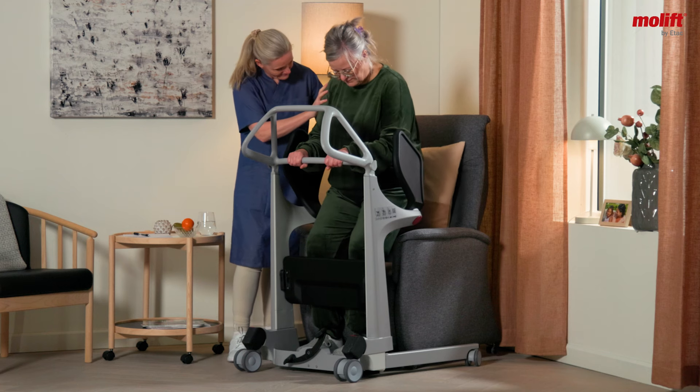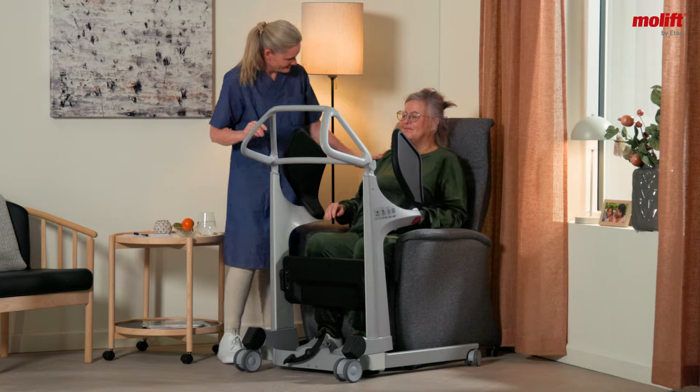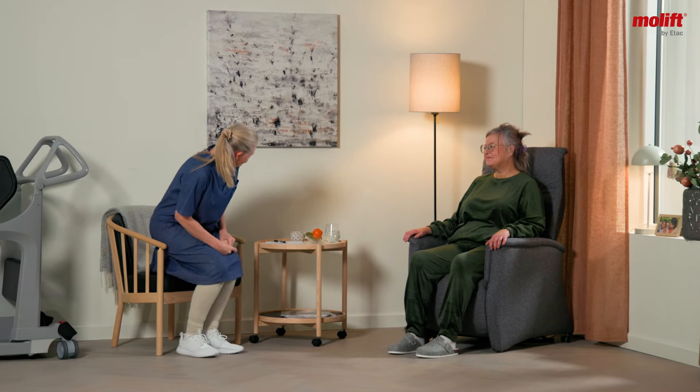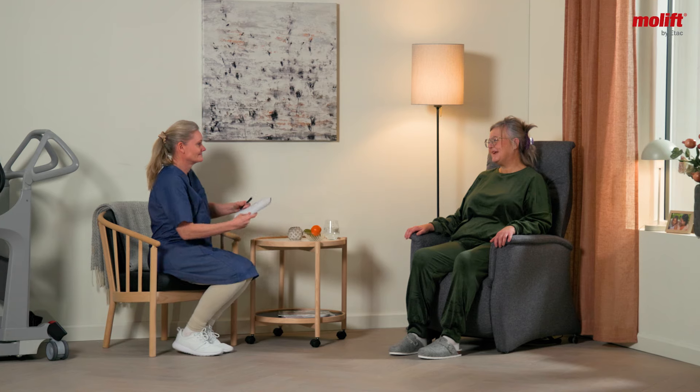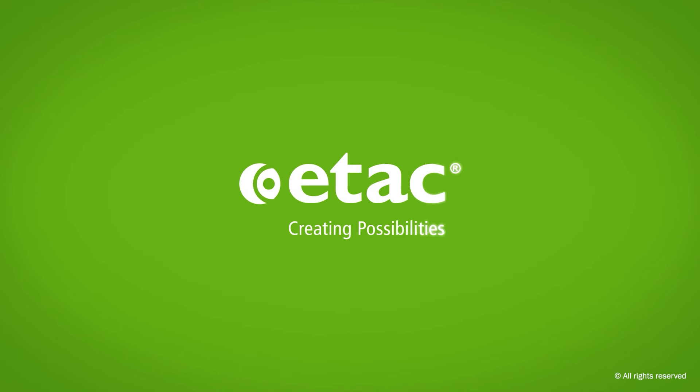MoLift Transfer Pro is designed to create a caregiver-friendly workplace in all kinds of care settings, while contributing to the enhanced well-being of the individual receiving care. ETAC – Creating Possibilities.